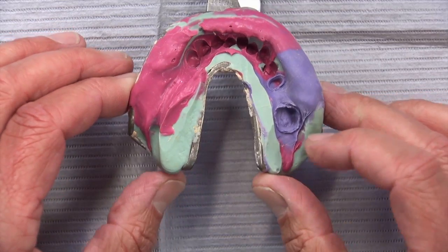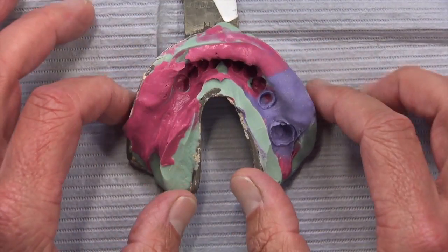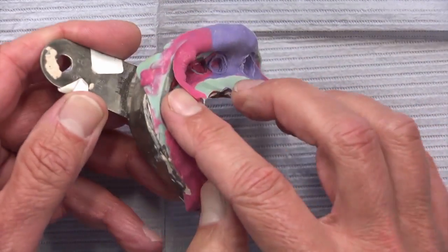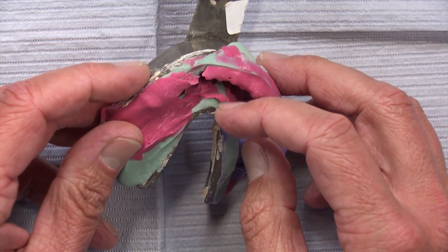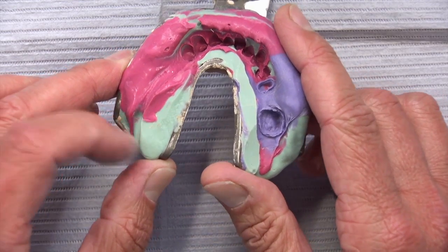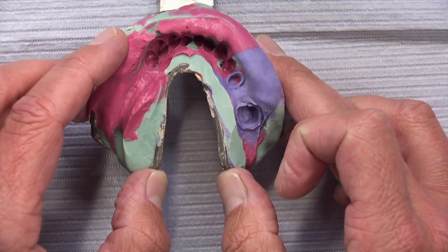This could be the Triple H because there's the original green material that was relieved, then relined with the red material, and when that wouldn't work out it was relined again a third time with the purple material. One sign that this was done in two phases is that the materials will separate from each other rather easily. If this was done as a simultaneous impression, the two materials will always stick together and will not be able to be pulled apart like this.